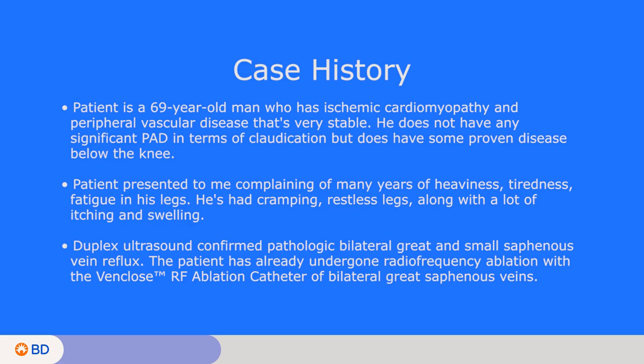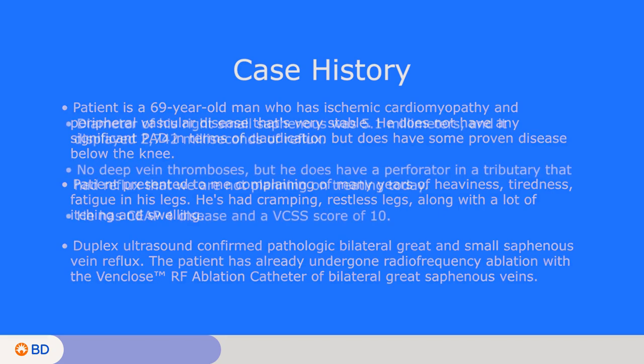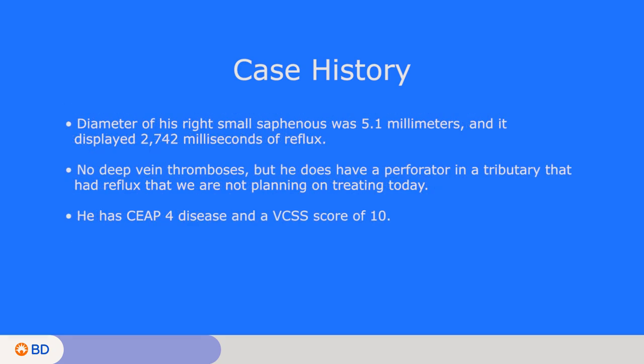We did a venous duplex ultrasound of his legs several months ago confirming pathologic bilateral great and small saphenous vein reflux. He has already undergone radiofrequency ablation with the Venclose device of bilateral great saphenous veins and now returns today to take on his right small saphenous vein.